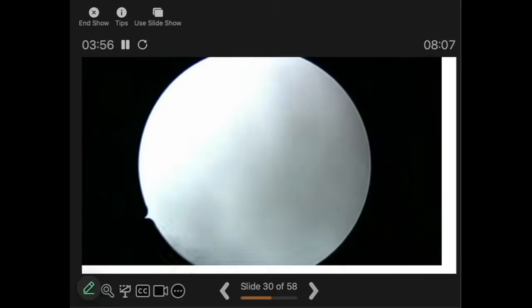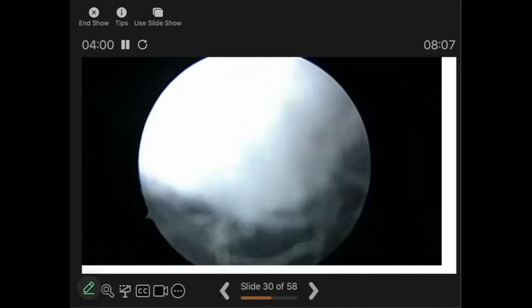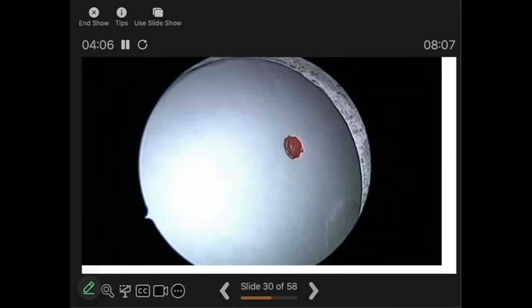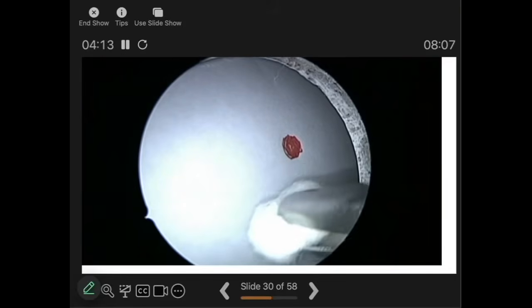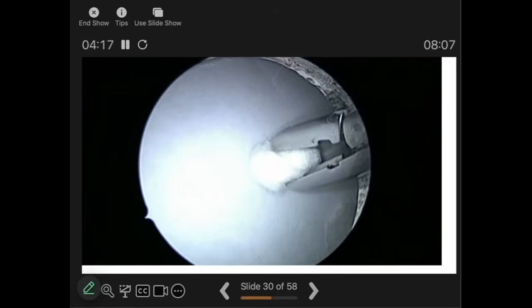If we put patties in between the endoscope and the bleeding point, then the bleeding point is not visualized. You cannot correctly place the patties. Whereas if you bring it from the side, making some angle, then you can bring it to the correct position.